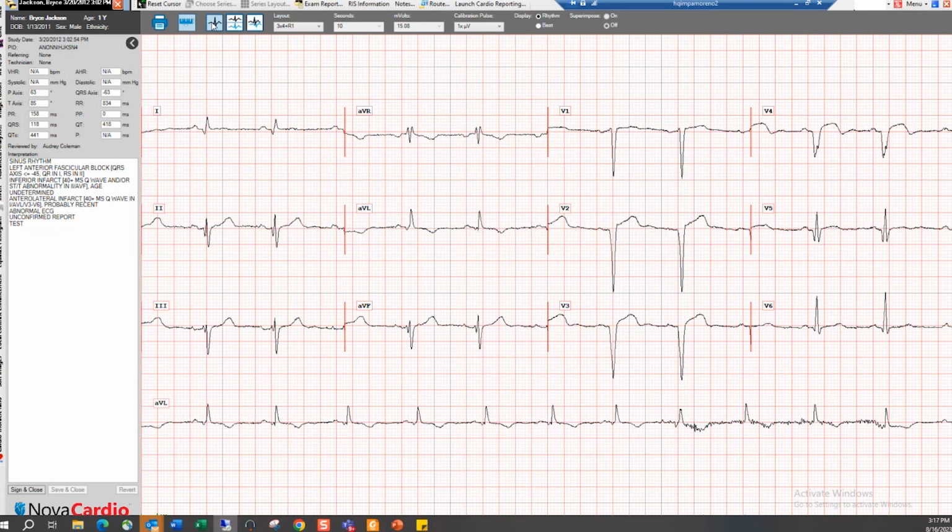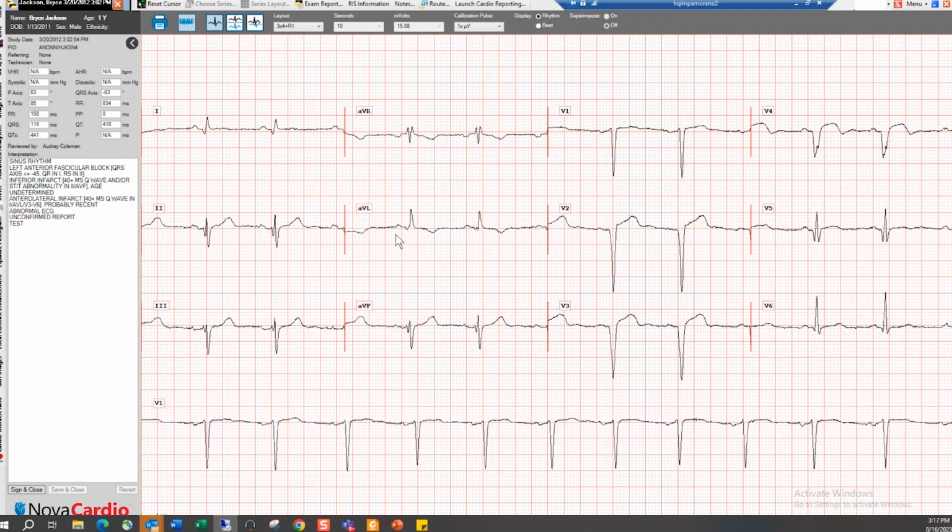So Tony, just to add a little bit more color here. There is a transformer box that can be added so that any ECG machine that can be placed on a network can go through the transformer box and be able to display ECGs within the system. So it does have more flexibility in that regard for older machines. Oh, thank you, Dr. Scott.